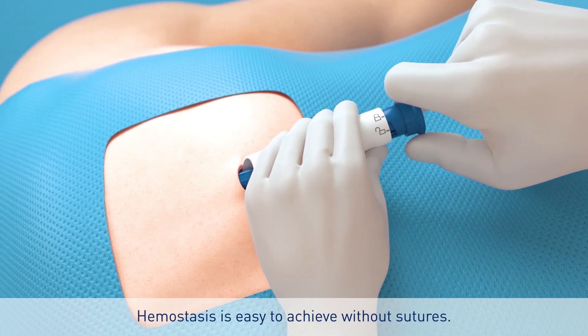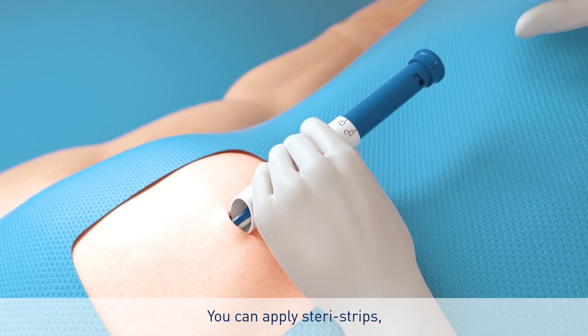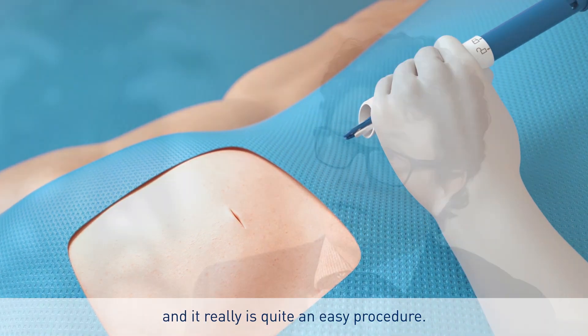You remove the tool. Haemostasis is easy to achieve without sutures. You can apply Steri-Strips and it really is quite an easy procedure.